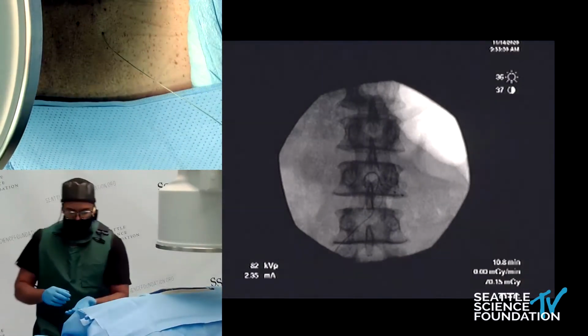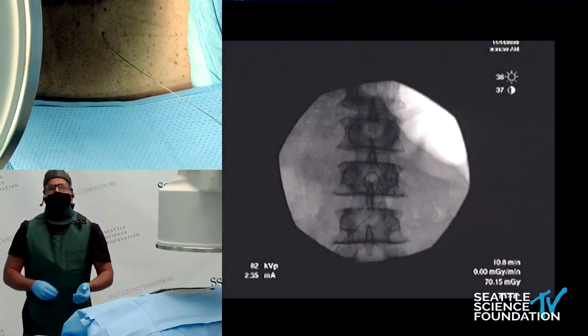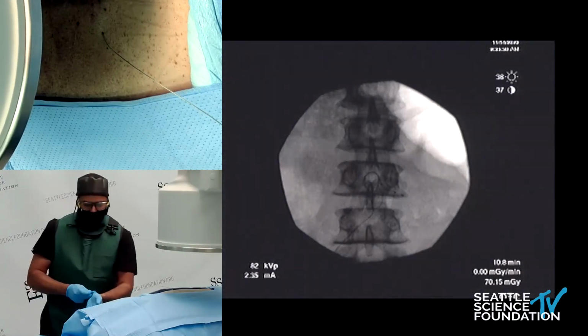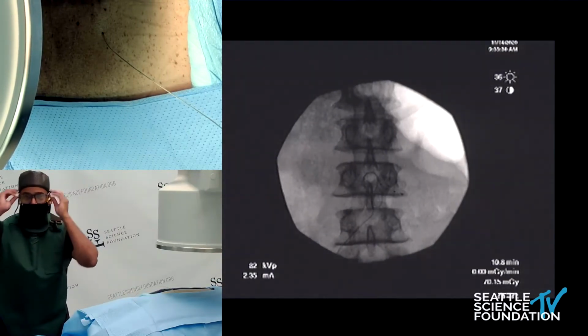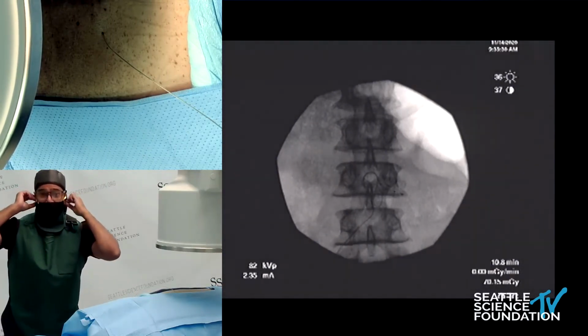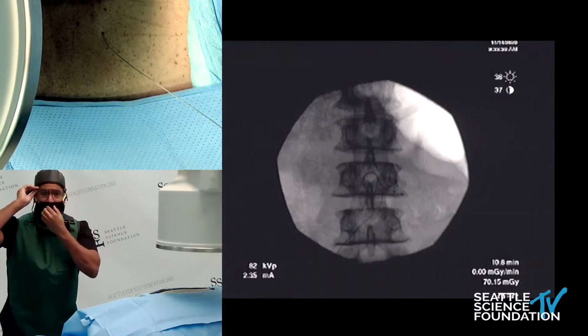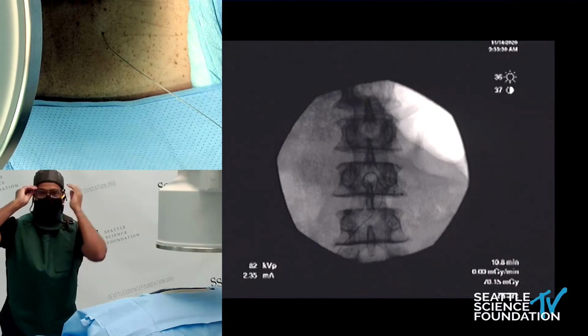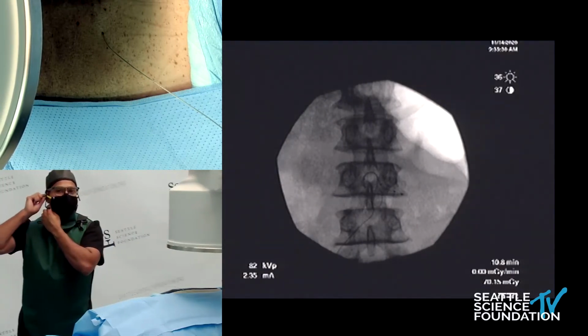So I would say that the most important thing you can do is really talk with your patients about IPG placement. One of the tips and tricks is to consider having them place a dental floss box over an area that they want to have the IPG. You'll probably read about and hear about very different places, whether it's the upper buttock or over the flank. These are all potential places.